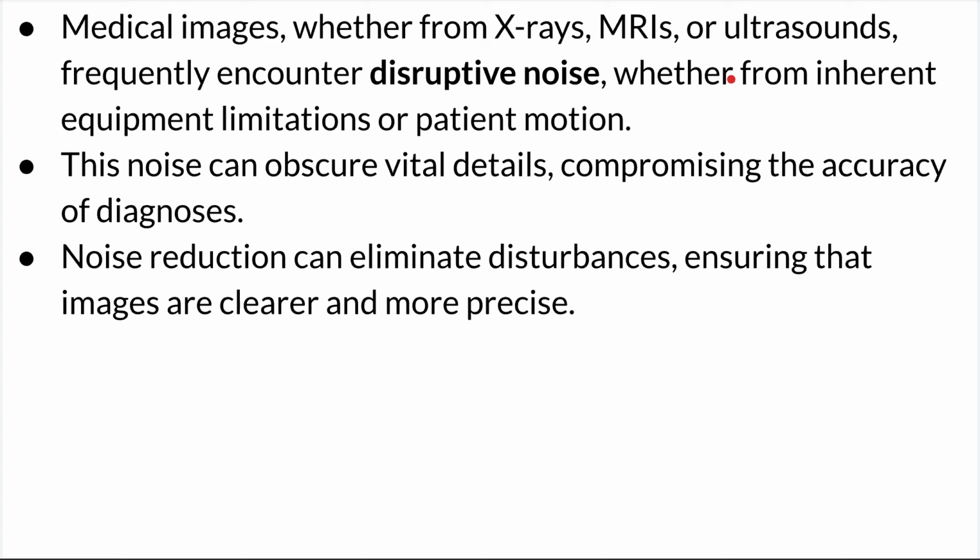So in medical imaging, images, whether from X-ray, MRI, or ultrasound, frequently encounter disruptive noise, whether from inherent equipment limitation or patient motion. I believe you know it, or you guys go for clinicals. So is it the patient or the equipment? Okay. And when you have noise, it can obscure information.